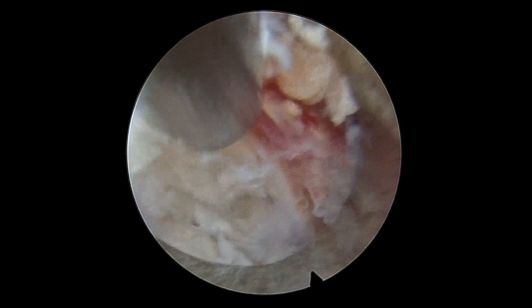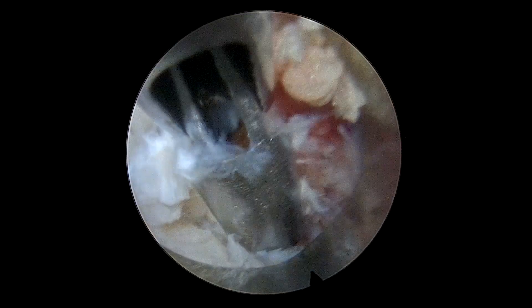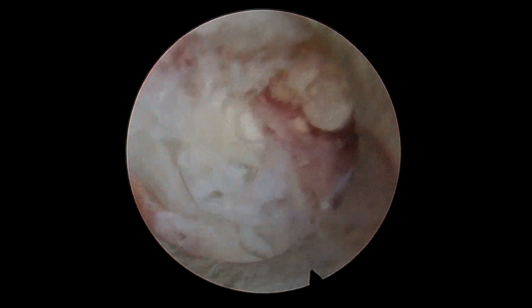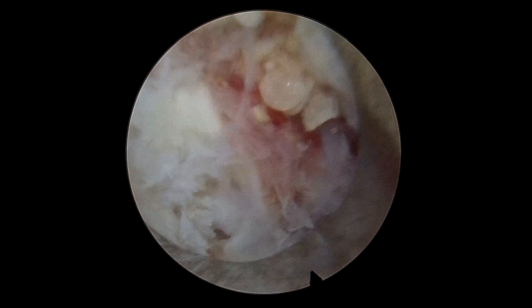Thereafter, there were some more disc fragments which were pressing on the root and were gradually teased off to relax the root.